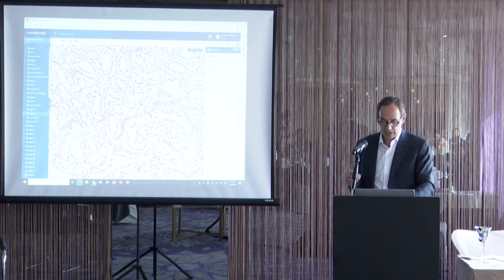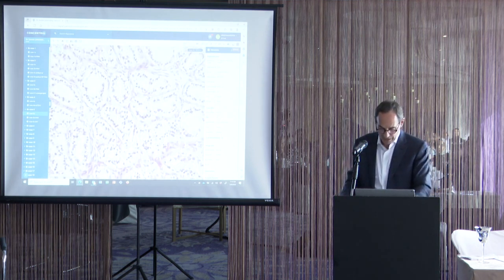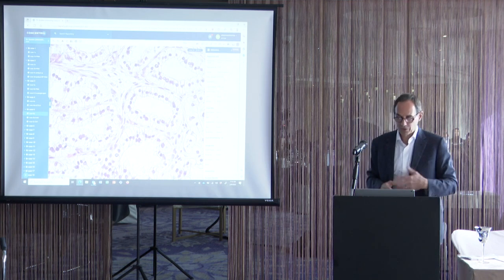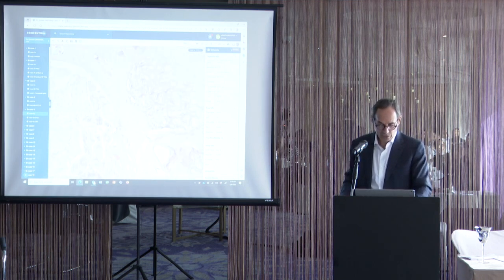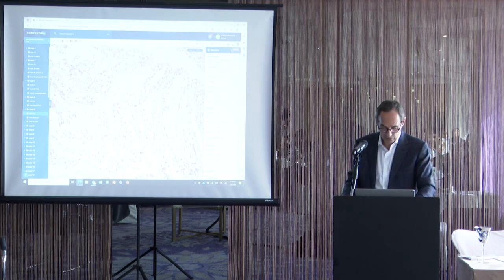Clear cell RCC, typically you don't see a prominent tubular component. And then very nicely, I talked about how you have the subnuclear vacuoles, reverse polarity with clear cell papillary renal tumor. We have that here. You also have to have low-grade cytology. They should always look grade 1 cytology. Here we have a little papillary component of the clear cell papillary renal tumor. That's totally acceptable as well.